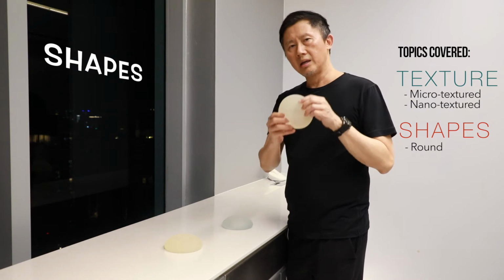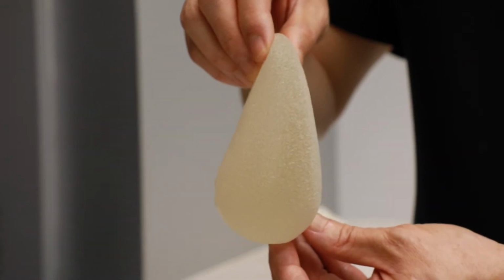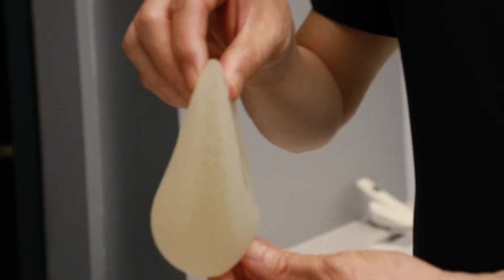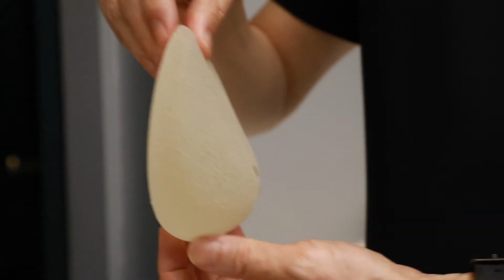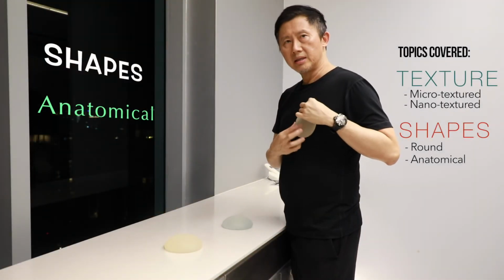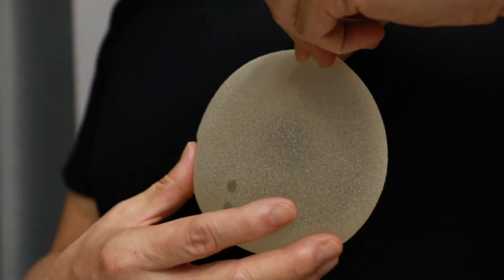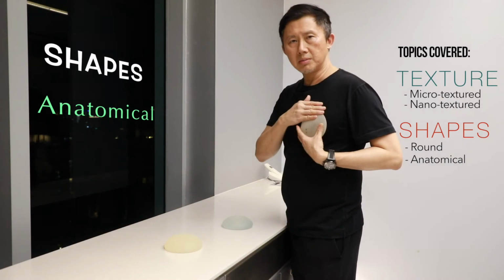And this is why the next generation of implant was developed, the anatomical implant. So as you can see, it's not round. It's shaped like a teardrop from the side. When this implant is placed in the body, the upper part of the breast doesn't bulge. So this produces a very natural shape.